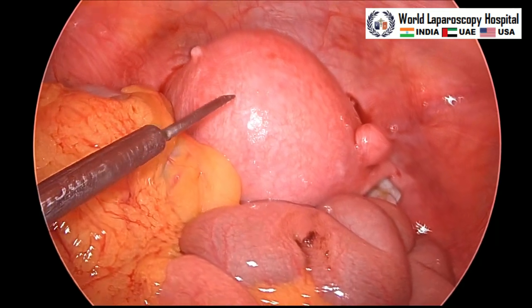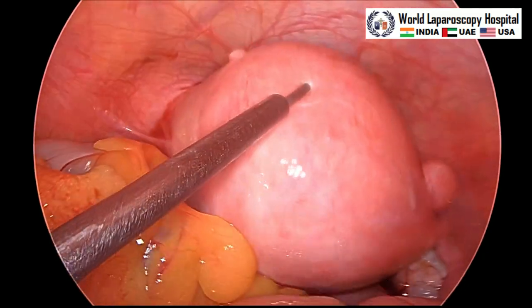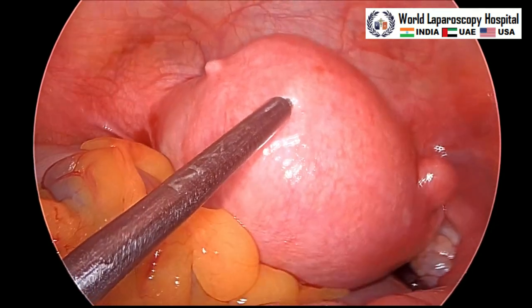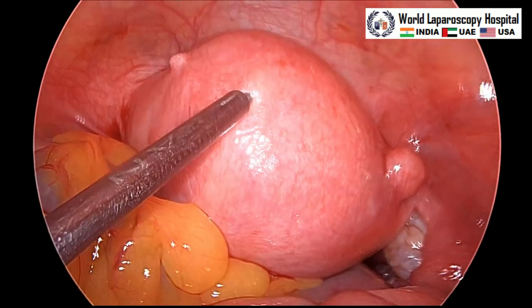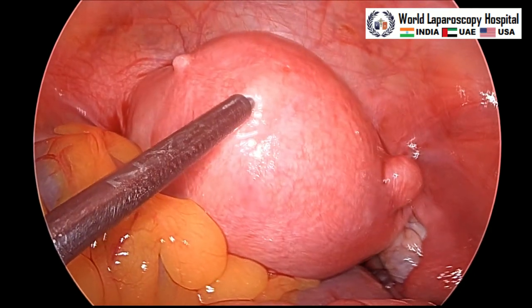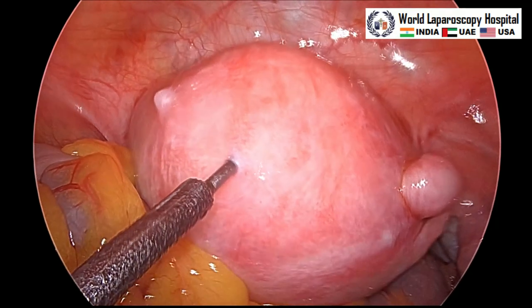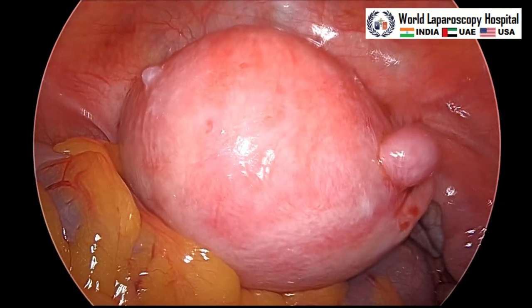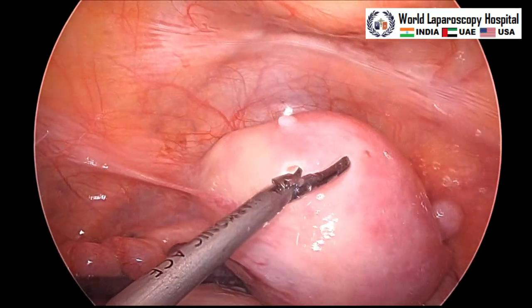So this is an anterior wall myoma. You can see the bulge also is on the anterior side, but it has a deep intramural component with the maximum submucous extension. So this is the vasopressin we are injecting. As you know, this is 5 international units in 20 ml saline. And we can see a marble white appearance now. It is becoming paler. And then with the harmonic, the incision will start.